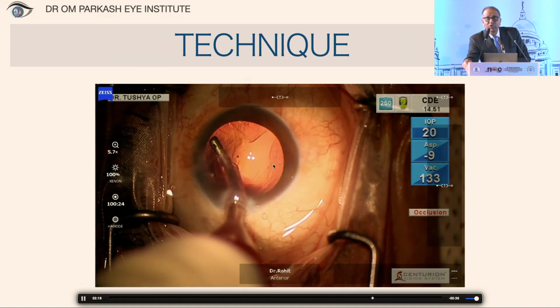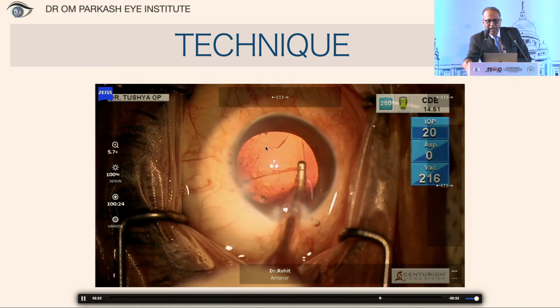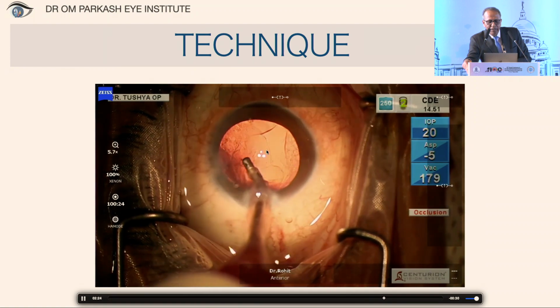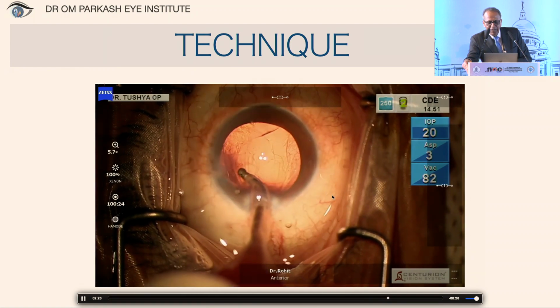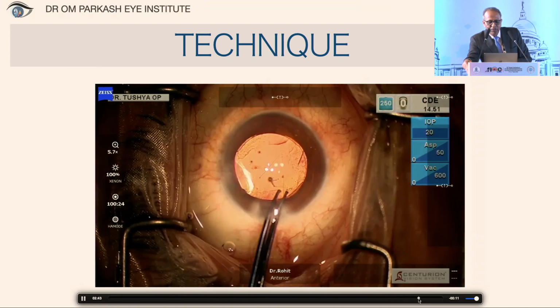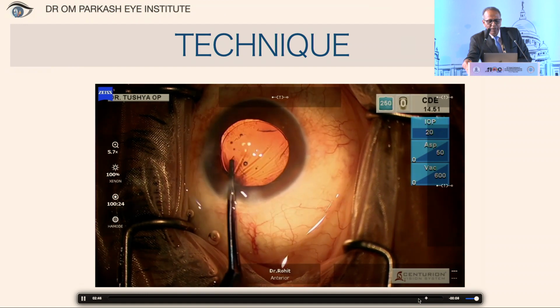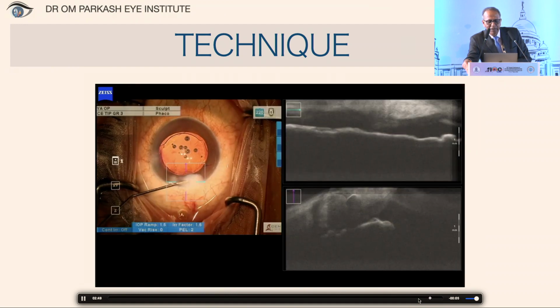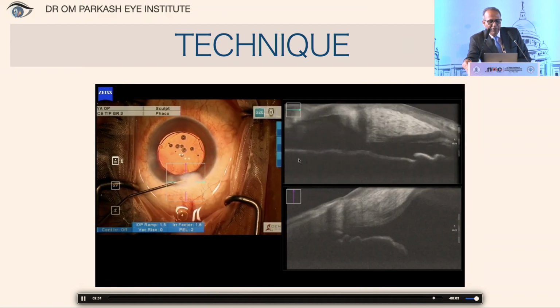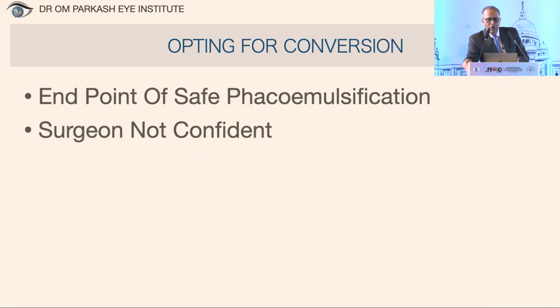And the next thing which I am doing is, you will see the flap is fluttering. I'm taking out the cortex remnant, whichever were there, and the process is again stable chamber settings. Intraocular lens implanted, trying to make the rexis slightly bigger, and while doing stromal hydration, the flap was still fluttering. So now the next thing is, do we always succeed?